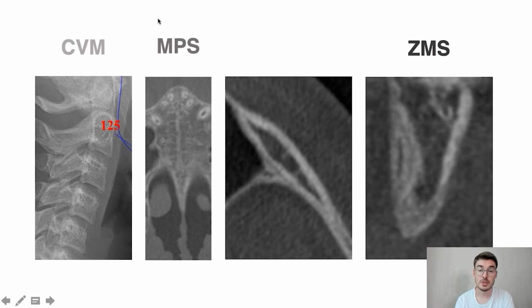We also pay attention to the mid-palatine suture. It is perhaps the main indicator to determine the possibilities and effectiveness of our skeletal expansion. In addition to the mid-palatine suture, we also need to analyze the stage of maturation of the zygomaticomaxillary suture. This is a rather specific suture for Marpe. There are axial and sagittal sections.